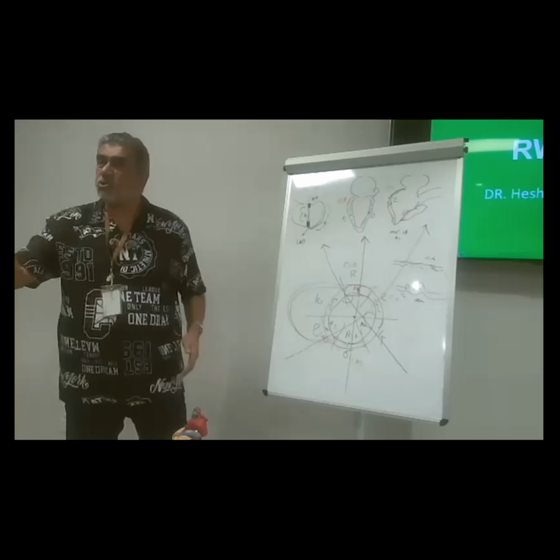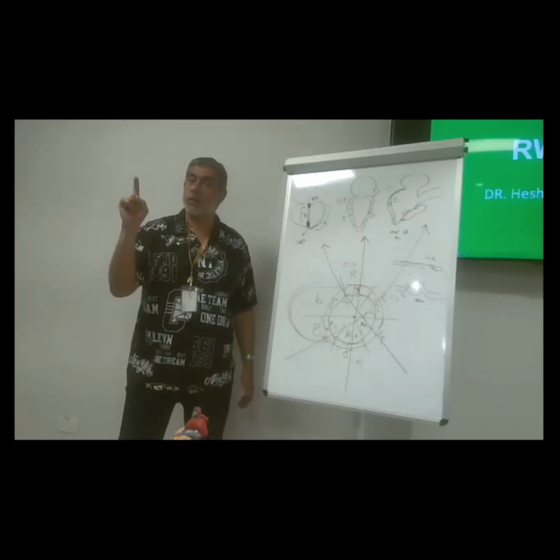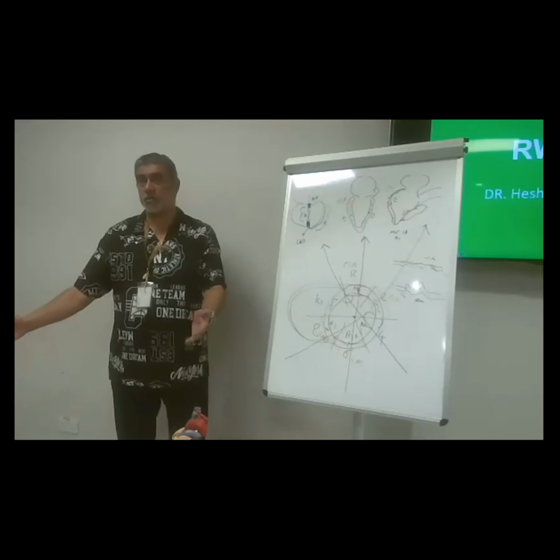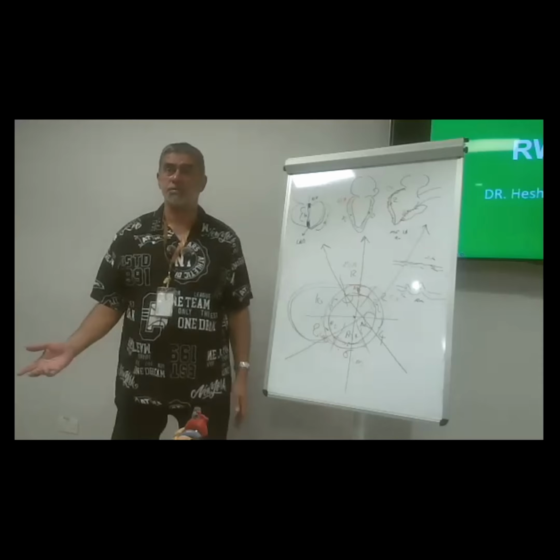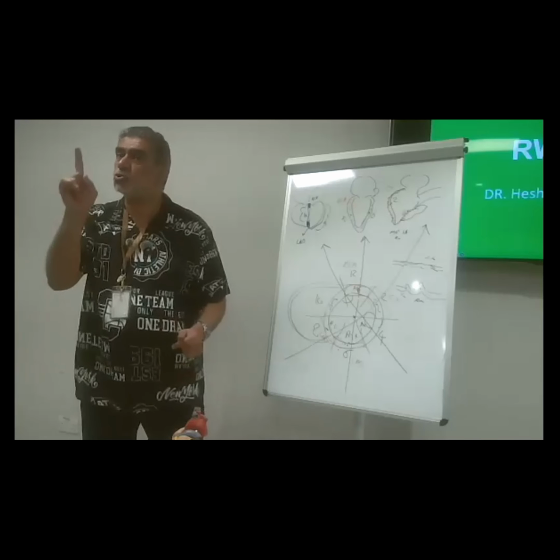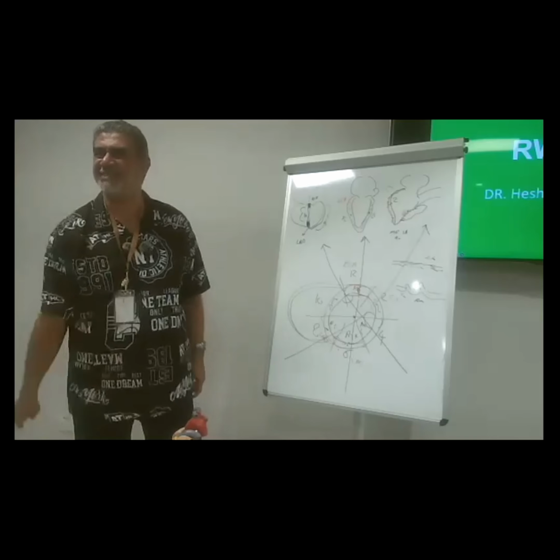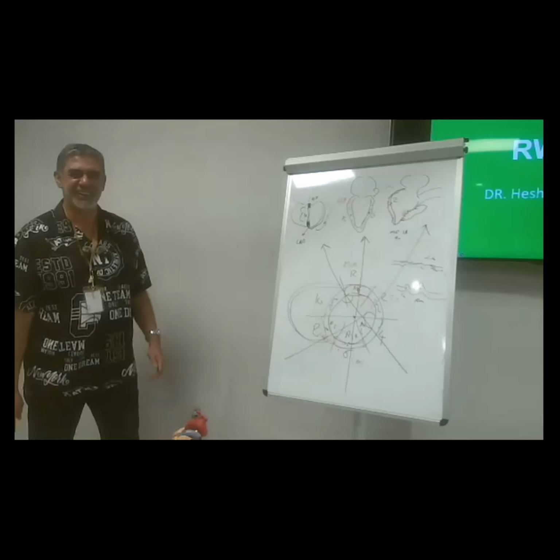But in regional hypokinesia, there is a specific reason. I gave you the examples. There's a specific reason, and usually it is iatrogenic, and usually it is the surgery.